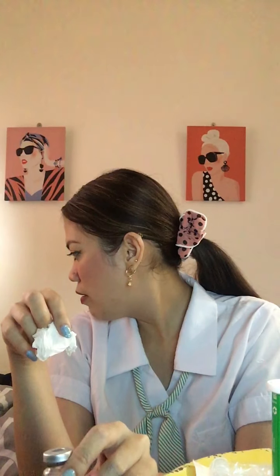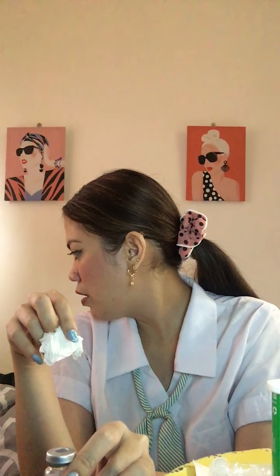Like tripping off, to prevent accidents, or so that you are not able to drop the ampule on the ground. So that's why it has to be on a flat surface. And then, remove the cap from the filter needle. So this is the filter needle; remove the cap from the filter needle.